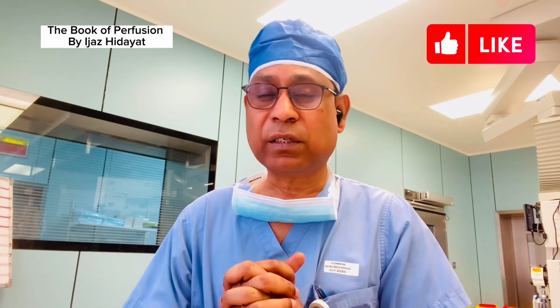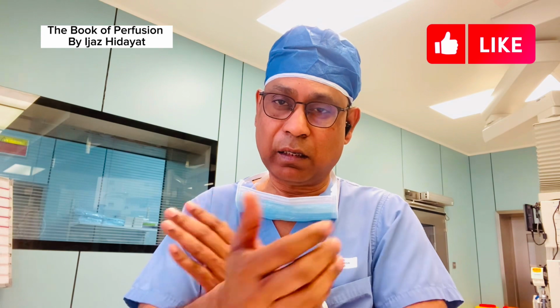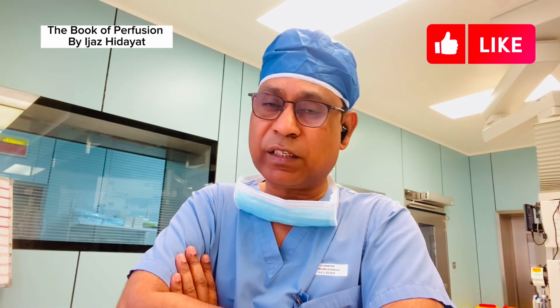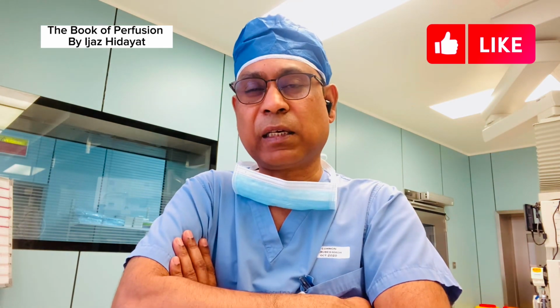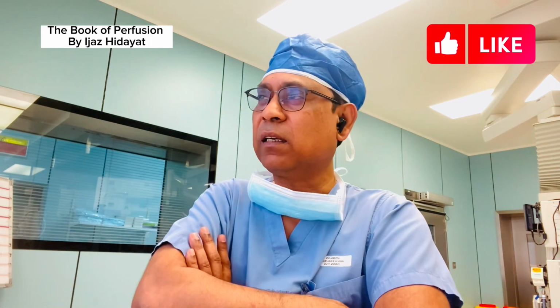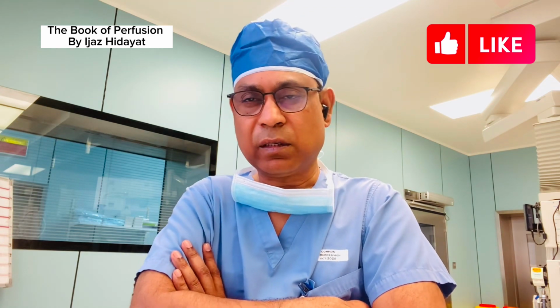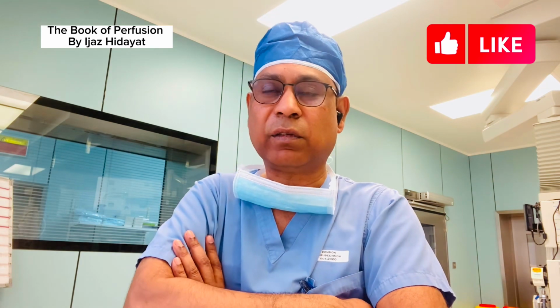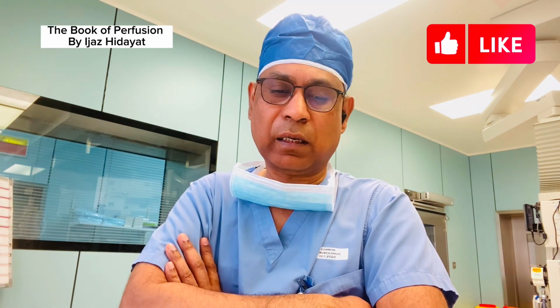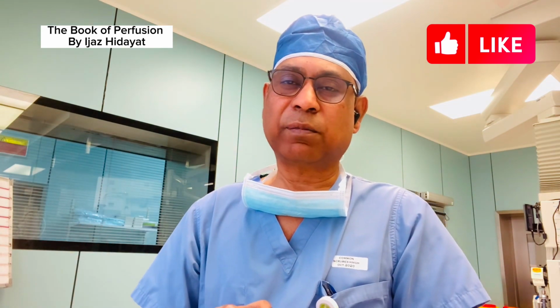so the last is your ECMO. If the patient is not tolerating the ventilation and is not maintaining saturations, you can go with central cannulation, and the same ascending and venous cannulas can be used as the ECMO cannulas, and it can be used for 2 to 3 days. You can shift your patient to the intensive care unit with the support of ECMO, or sometimes you don't require ECMO support.